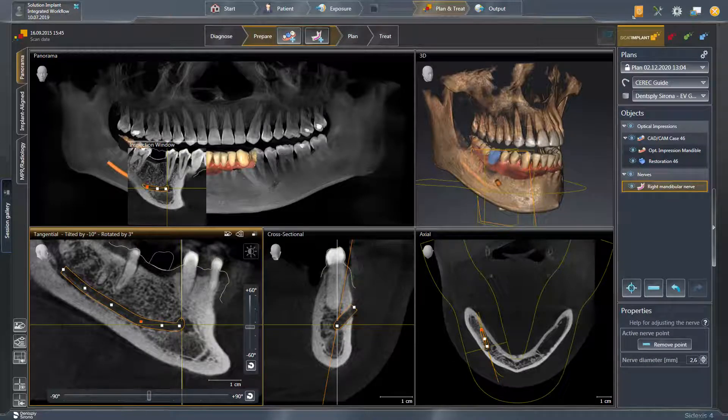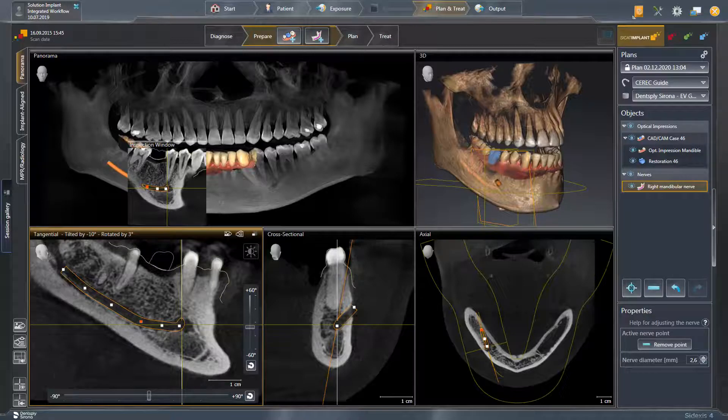In case you would like to discard the nerve path, you can do so by clicking the button with the minus sign. Now, we can proceed with the plan step.